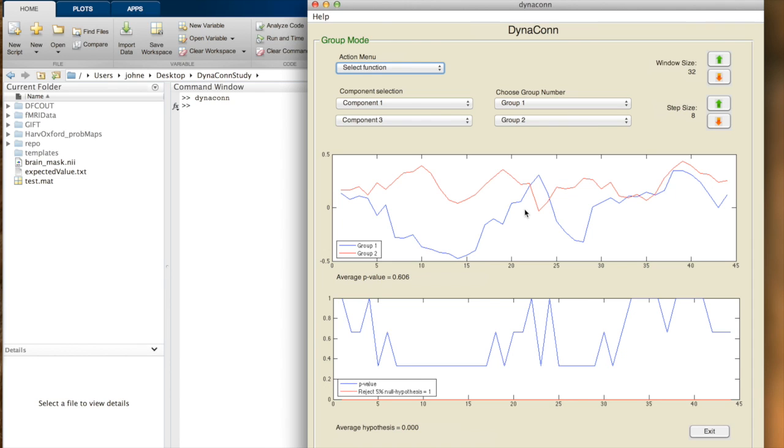And that is about it. Lastly I'll say one thing you didn't see is that whenever I select the matrix display, it will ask if you want to let it calculate all of the DFC results, and depending on how many subjects and how many combinations you have, it could take a while, but I had already done that ahead of time, and so whenever I loaded this setup, it stored those pre-calculated DFNC results, so it just pops right up.